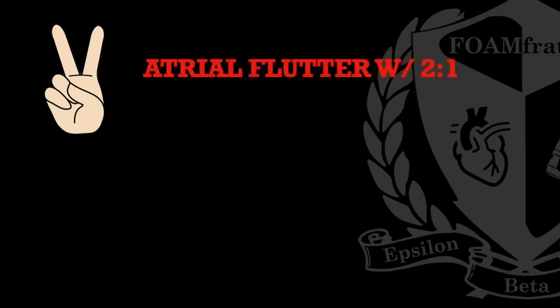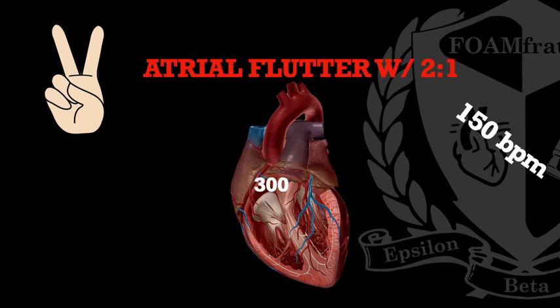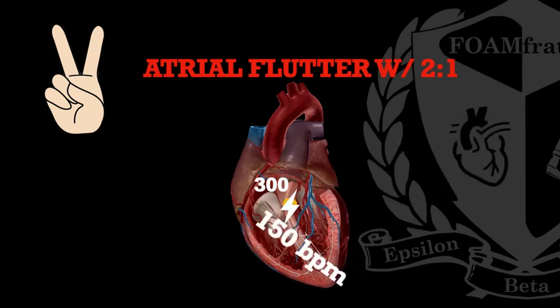And so when I evaluate atrial flutter with 2-to-1, or I'm looking to possibly make a diagnosis, if I have a 12 lead in front of me that's showing a rate of about 150 beats per minute, usually plus or minus 10 in either direction, that's usually what's cluing me into this could potentially be atrial flutter with 2-to-1. And the reason that this happens is because the atria flutter at a rate of about 300 beats a minute. The AV node is functioning properly, and what it's doing is it's terminating about half of those impulses. And so if we're terminating half of 300, that's usually what results in our ventricular rate specifically in and around 150 beats per minute.